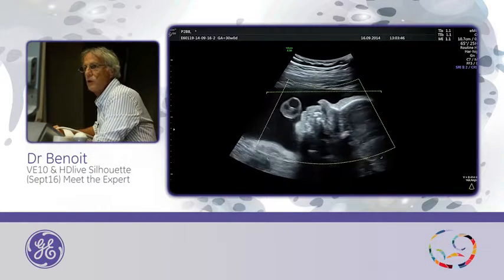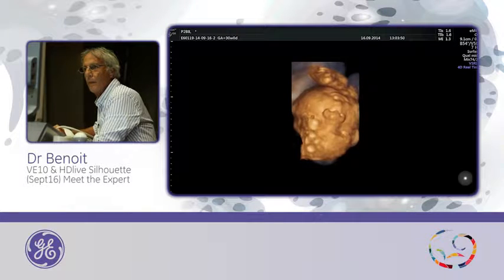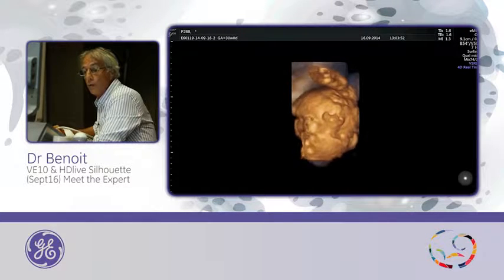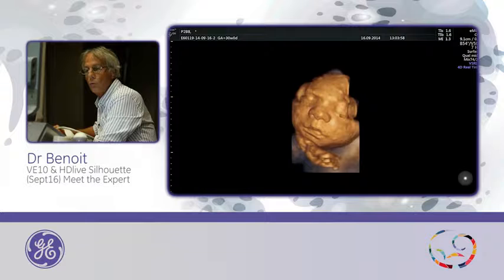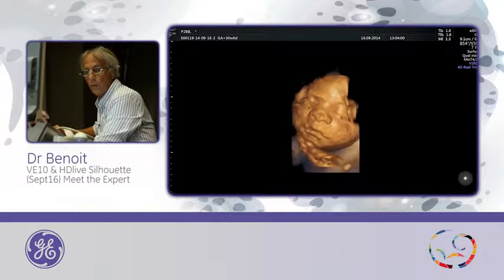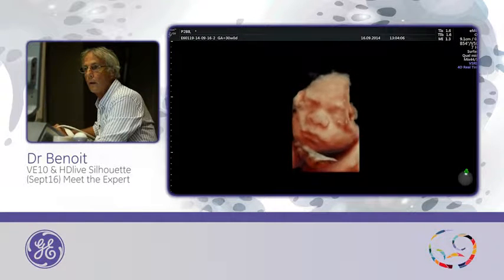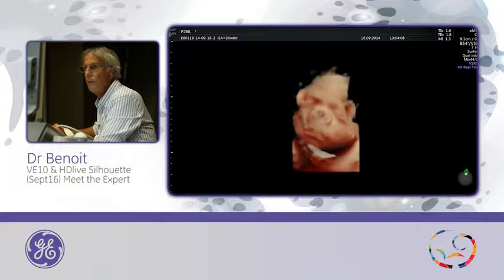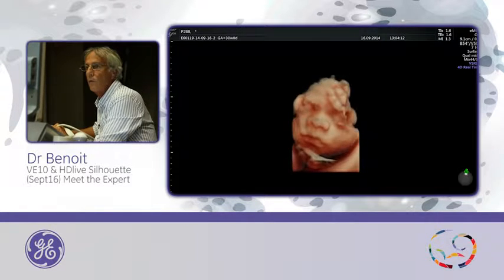I need my foot switch. Yes. Okay. Good. I need to invert, and I need to go back to main render, to HD Live, and you will take the first one, this one. So this is 4D, and we are now at 7 volumes per second.